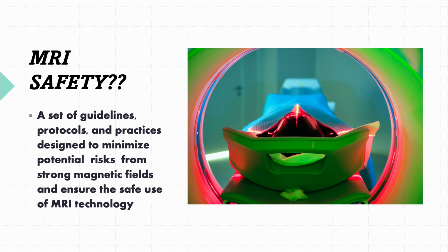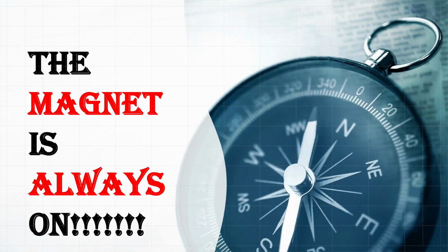Okay, so let's define MRI safety. In very simple terms, MRI safety encompasses precautions and protocols to minimize risks and to ensure the well-being of individuals during an MRI procedure.